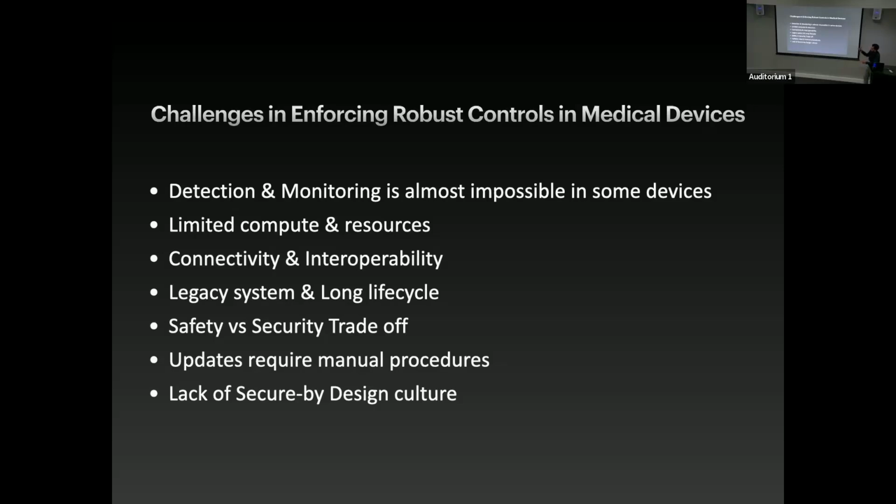Then some devices can only be updated via manual procedures. Some devices can only be updated via USB, in person. Maybe they don't have a remote connection, or they're very old. So that's still applicable. It stops your process of issuing security releases, even though you have issued new releases and software patches. It's not possible for those devices to take them in.